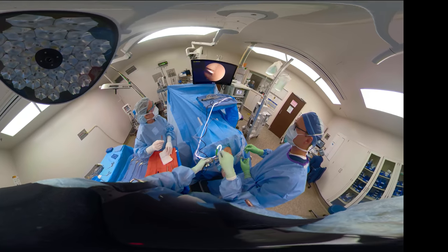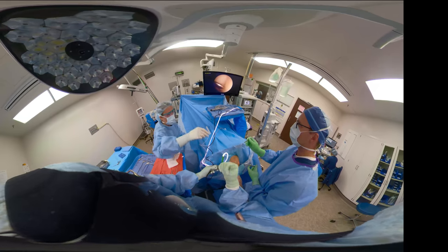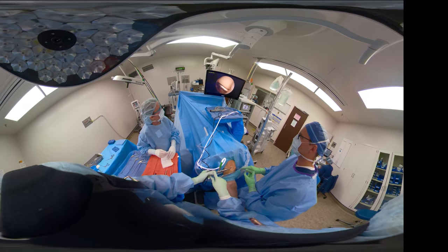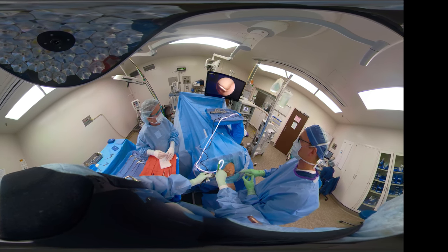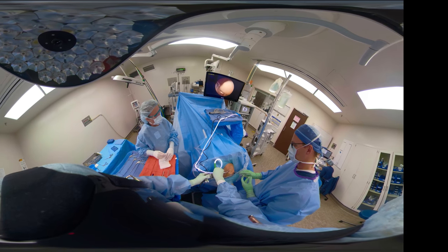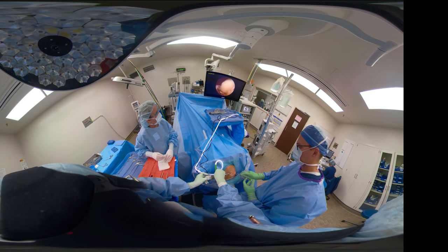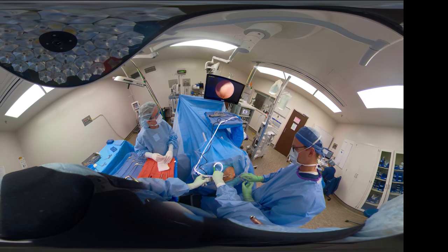And I have the scope now, so sometimes you use this as a dual effort, so to speak. So he's got the Schlesinger, and we're going to be pulling on the loose body, and then as we pull, we'll do an increase in the arthrotomy so that we can get that out without losing it. If you end up having a large loose body like this one and you lose fluid through that medial portal, you can always put a suture in and then proceed with the remainder of your arthroscopy.